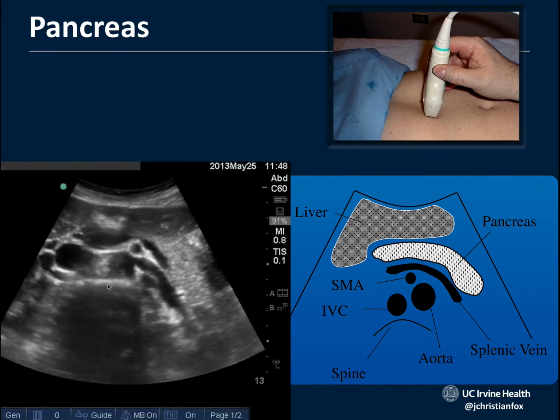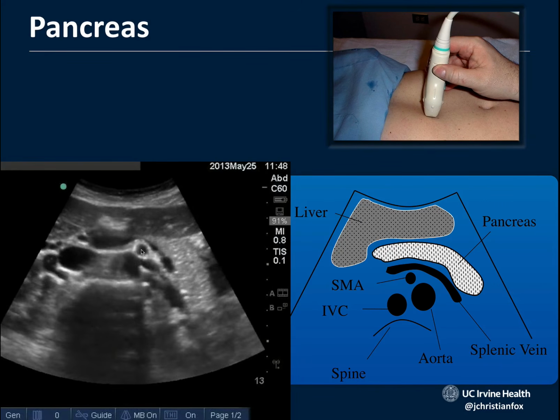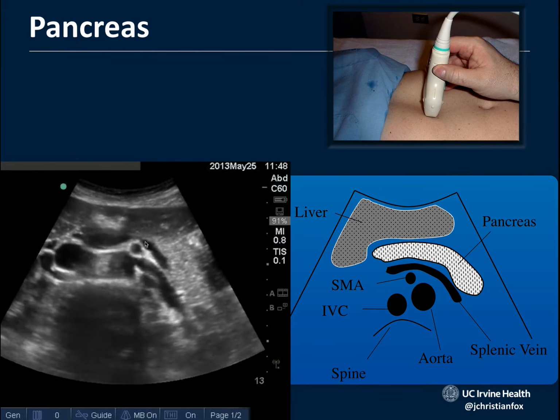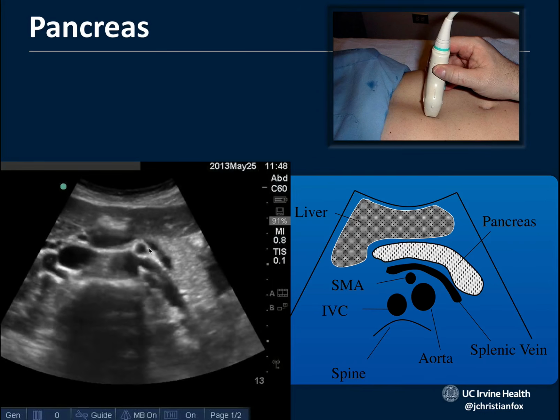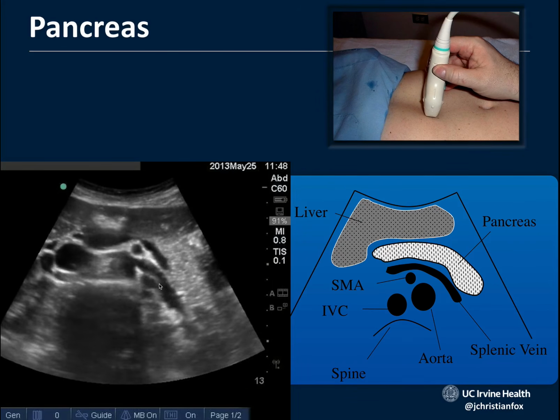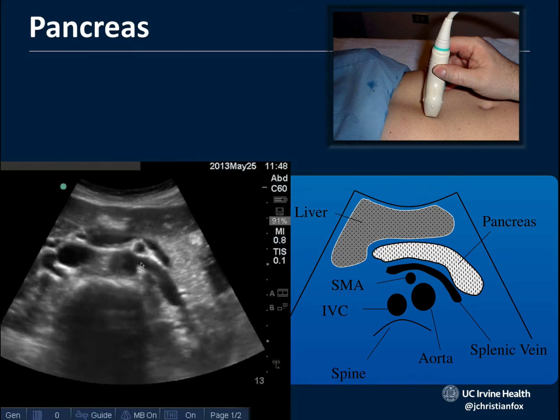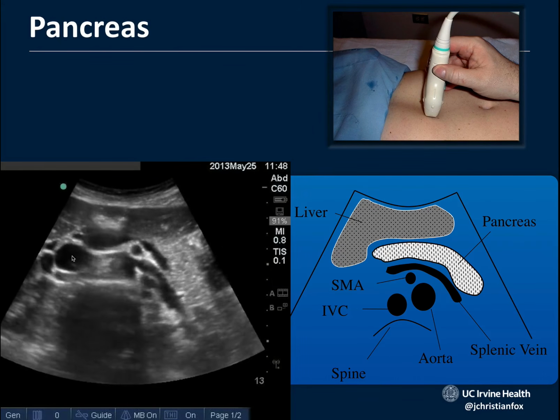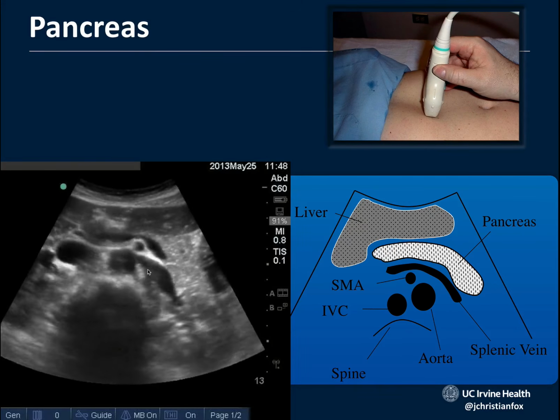And so we can see again on this screen over here, just to review that, aorta, IVC, SMA, splenic vein is crawling over the SMA, and we see the left renal vein getting nut cracked, coming across, trying to drain into the IVC between the SMA and the aorta, left renal vein.